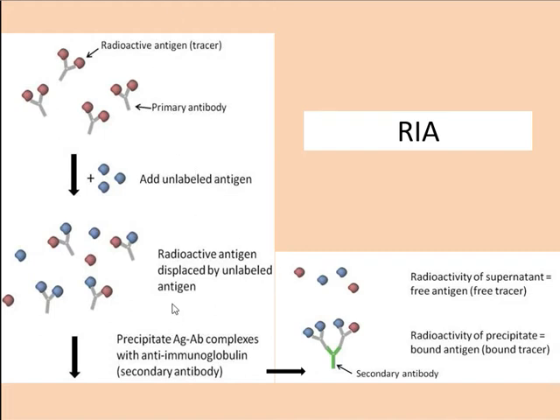That means, if there is more labeled free antigen displaced, that means there was more antigen in the patient sample.